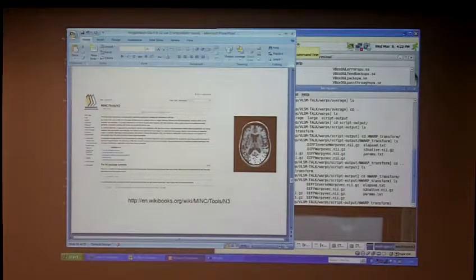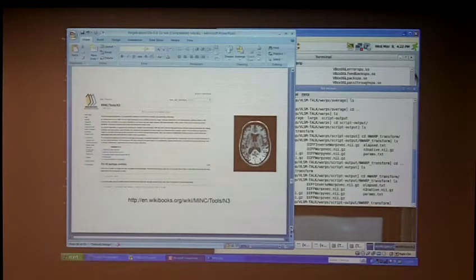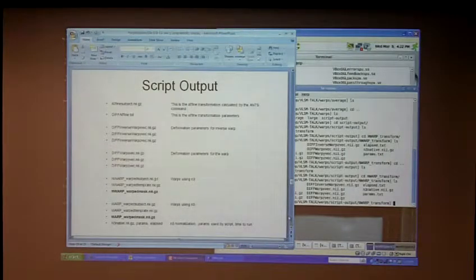And obviously you can get the N3 tool from there. I'm not sure. Is N3 built into ANTs? No. Or does it come with ANTs? It's from Montreal. Yeah, I didn't know if Brian includes it within his ANTs. There are other ways to correct inhomogeneity. I know the secret to making N3 work. So that's why we tend to use N3.